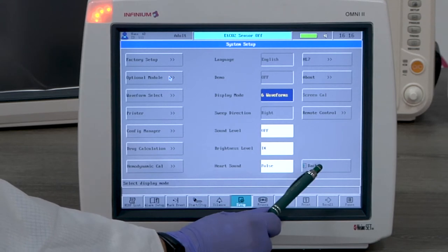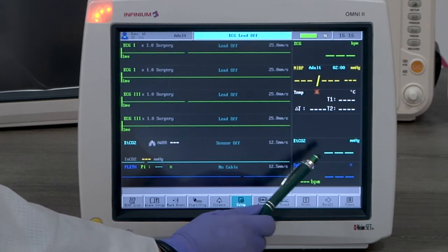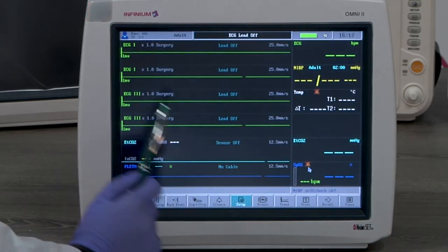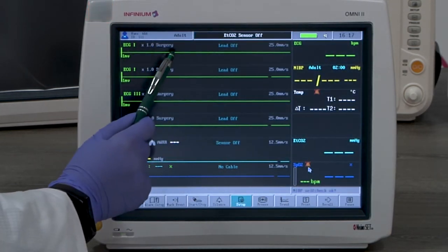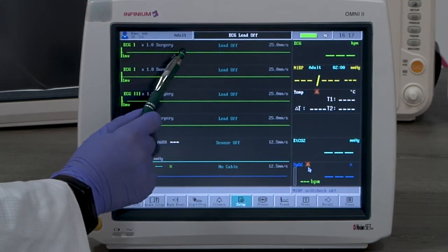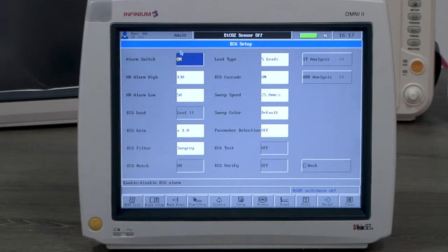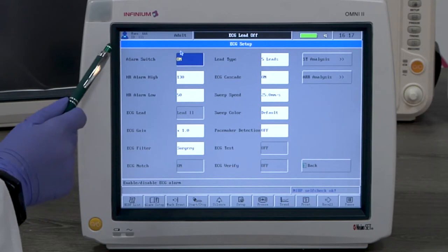Now let's look at ECG monitoring. By tapping on any ECG window you will enter the ECG menu. Here you can change all available settings to fit your needs.